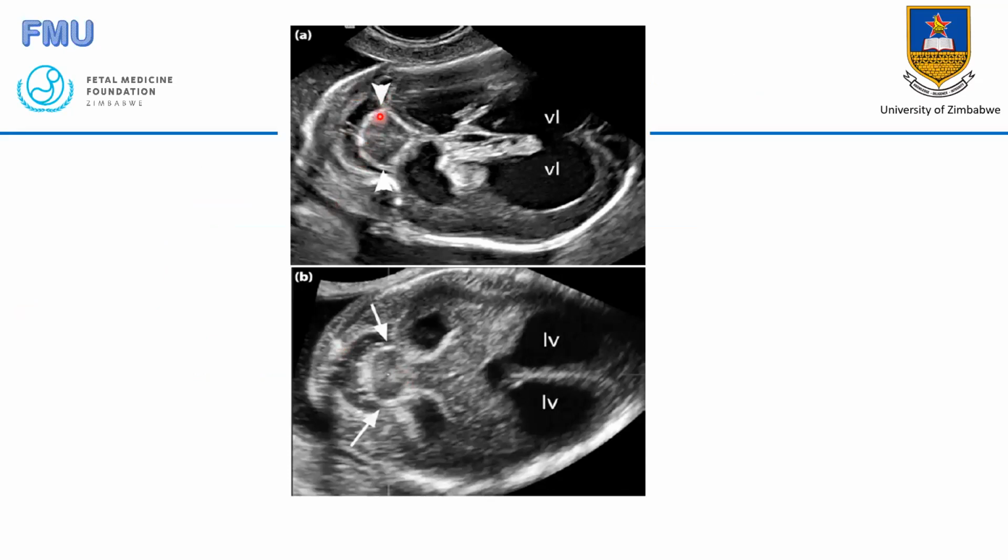Look at this TCD, very tiny. Look at the cerebellar lobes, they're just fused with each other. In this case, of course, there was an association with ventriculomegaly here. But you can see here just fused cerebellar hemispheres there. That's rhombencephalosynapsis.